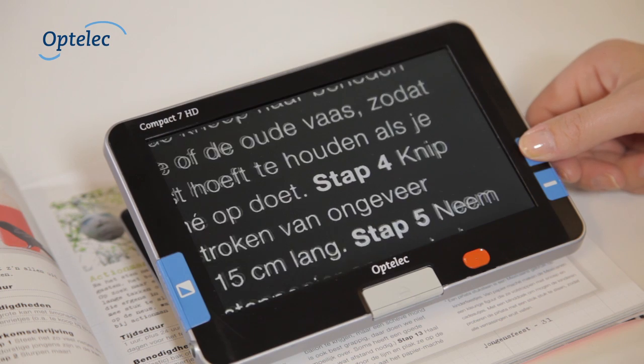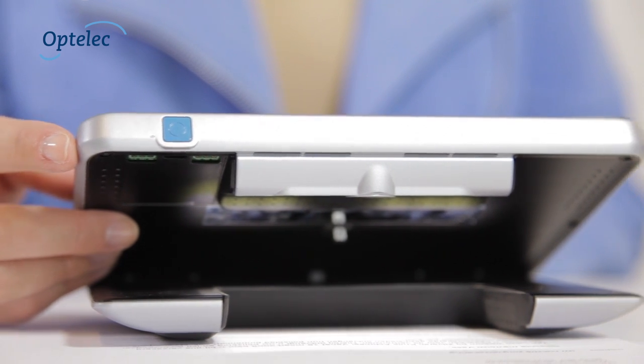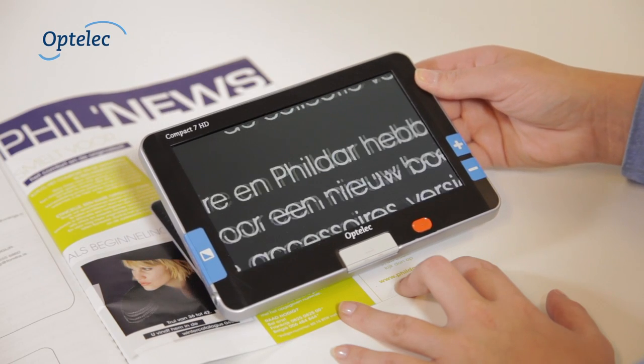To adjust the magnification, press the Plus or Minus button. The Compact 7 HD is designed to slide over documents smoothly. The unique lighting concept creates an even image which is not affected by light reflections.